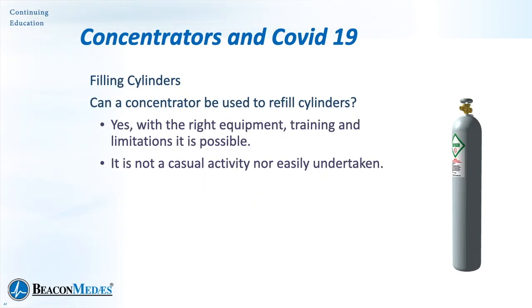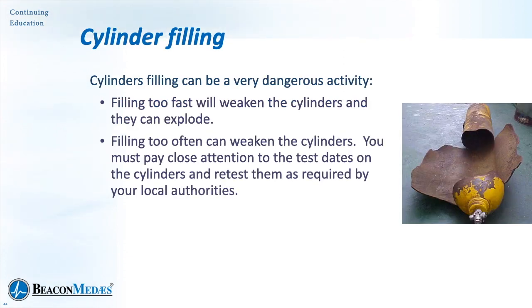Can a concentrator be used to refill cylinders? Well, yes, it can. With the right equipment, with the right training, and with appropriate limitations, it is possible, but it's not a casual activity, and it shouldn't be undertaken easily, because cylinder filling can be very dangerous. If you fill a cylinder too fast, the cylinders can explode. If you fill them too often and you don't pay attention to the test dates, they can explode.